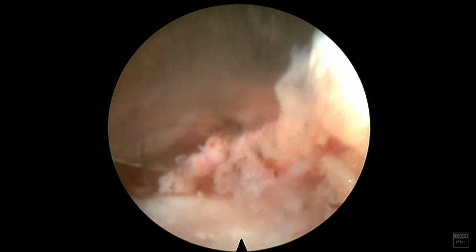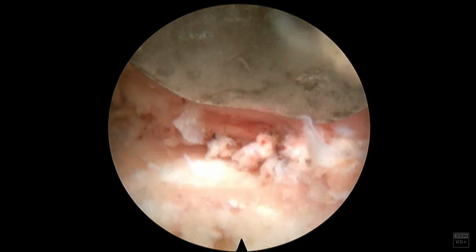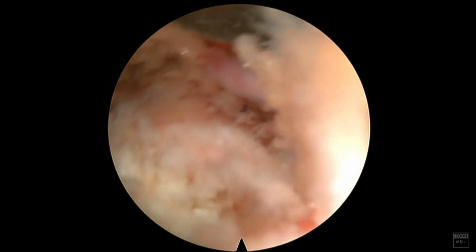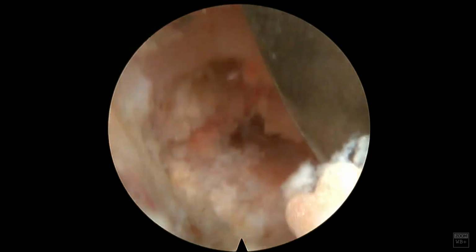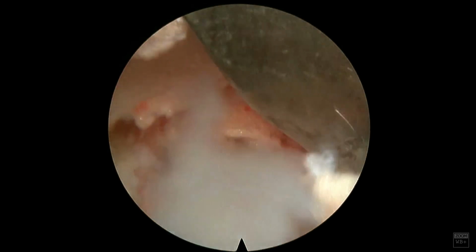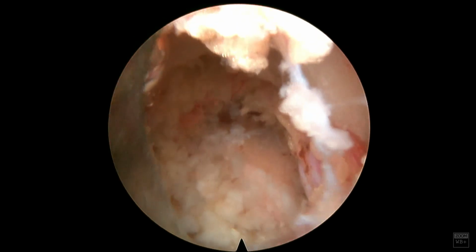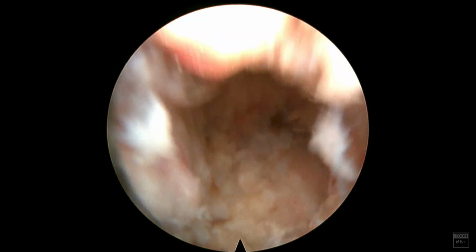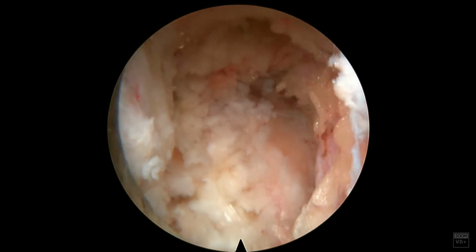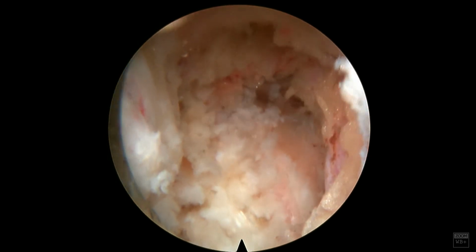Again, I'm really not going to spend too much time going into that corner because even though you can kind of see it, you don't want to get too far in there because the nerve does take a pretty oblique angle at the L5-S1 disc space. That's really been evident when I've done these cases, to learn the anatomy of the exiting nerve root. It's been really great to actually see how the L5 nerve root travels. So again, great view here.